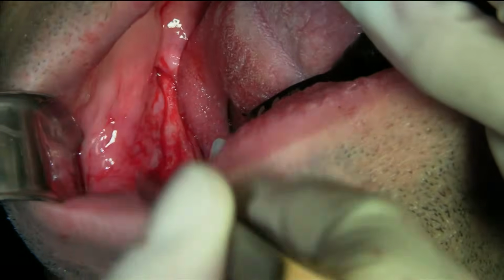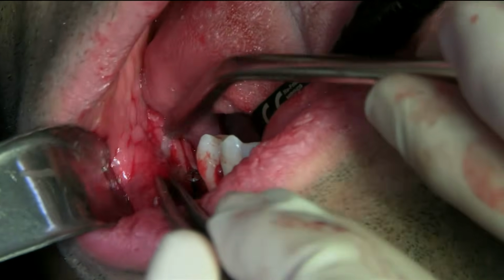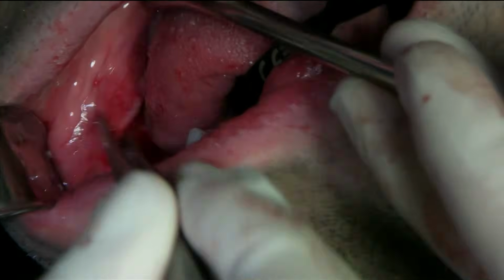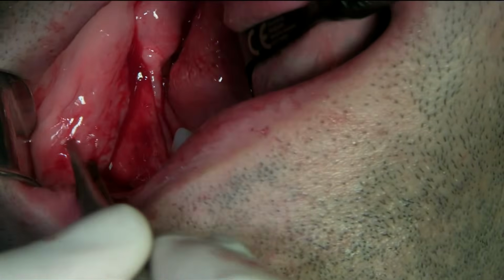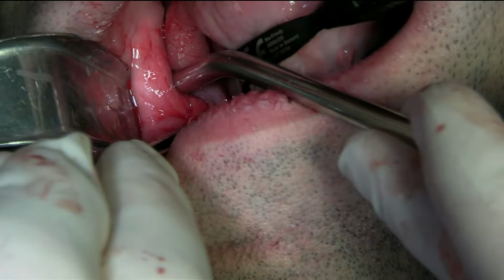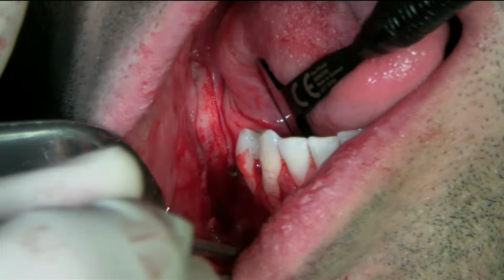So I am in my last phase of just checking that the buccal is completely released. I'm concerned about the mental foramen because that's often where it hangs, but no, this looks loose. You can see here, I can move this. Yeah, if you can keep your tongue as still as possible, it would be a hard one. I know it's hard. This is all loose. Okay, good. We got good bleeding from the periosteum, so that's good.